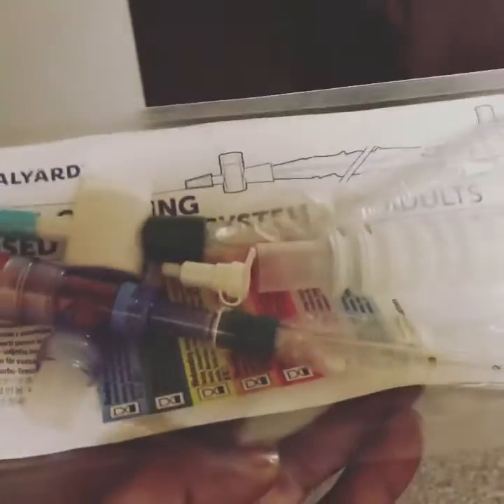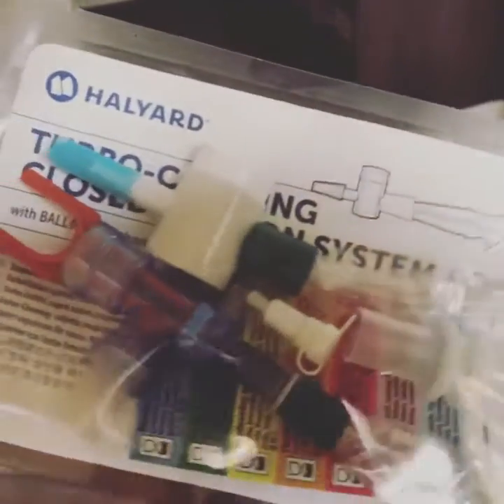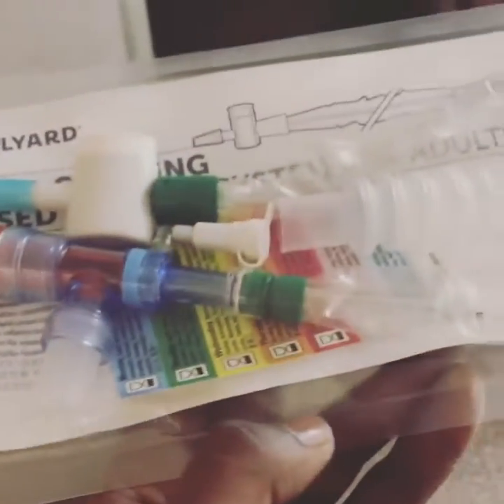This is our Ballard closed suction system that we have for patients that are intubated. After the patient is intubated, an endotracheal tube is placed in the airway — size 7, 7.5, or size 8.